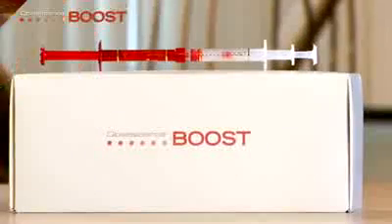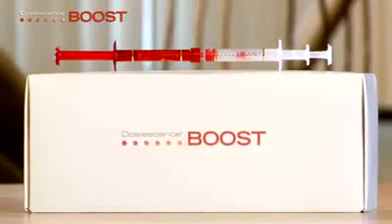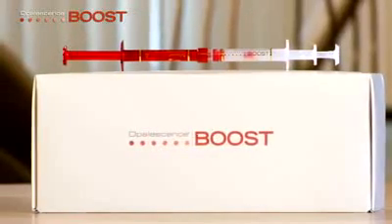If additional whitening is desired and no significant tooth sensitivity is observed, schedule the patient for repeat treatment at least 3 days following the initial treatment. Be certain to read the product instructions, warnings, and information for the patient contained in the package, and advise the patient accordingly. Most all clinicians who provide in-office bleaching follow up with tray bleaching. This assures bleaching further distally in the arch and/or to achieve ultimate level of whitening.